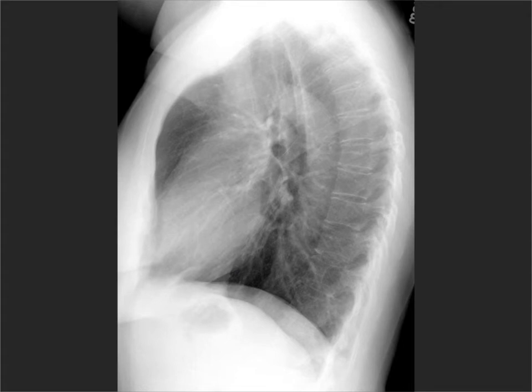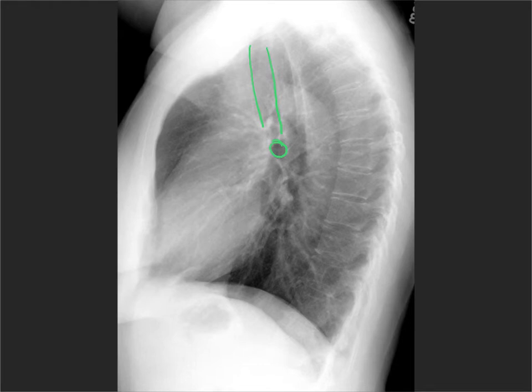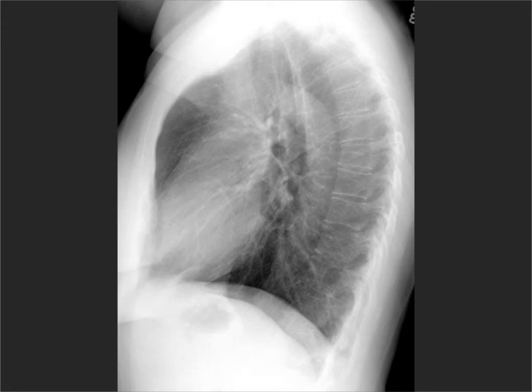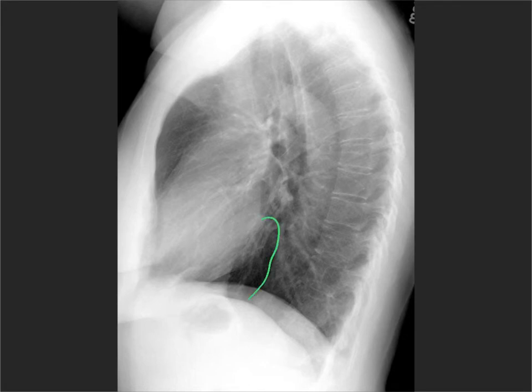Now let's look at the lucencies. We have our trachea — it's going to be lucent because it fills with air, coming down here. You'll always see this round lucency here, which is the left main bronchus, and the left upper lobe bronchus usually leads off it. The right upper lobe bronchus we'll sometimes see between the left pulmonary artery and the aortic arch. Most patients the esophagus does not contain gas, however if it's dilated and full of gas, we know it's posterior to the trachea. This lucency between the aorta and anterior to the IVC is a bit of a fake-out — not a real structure.